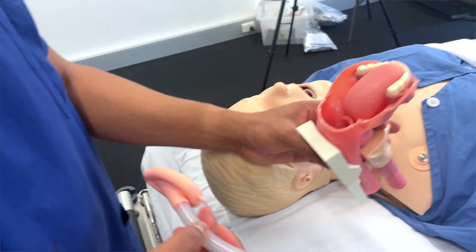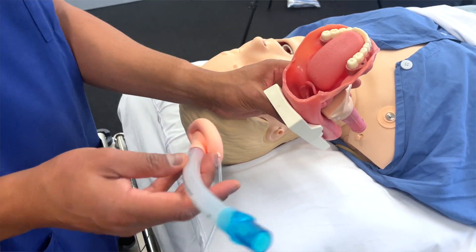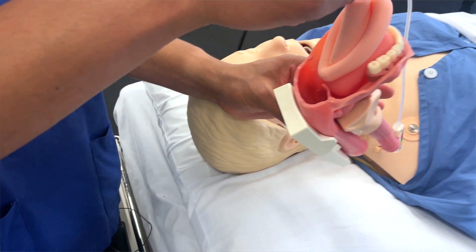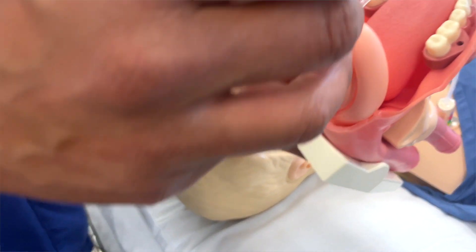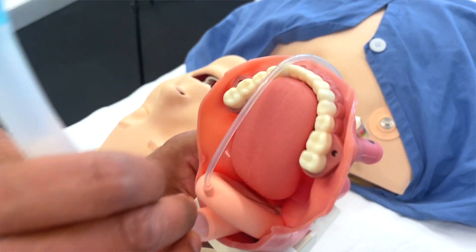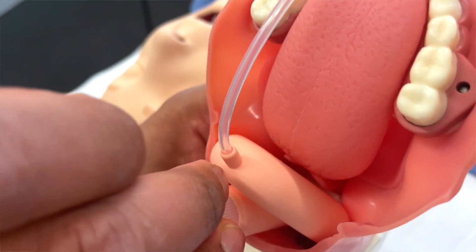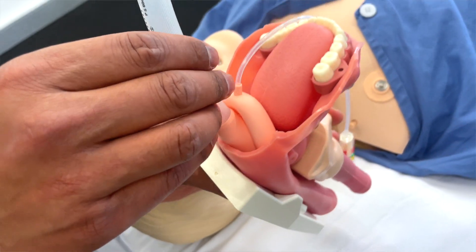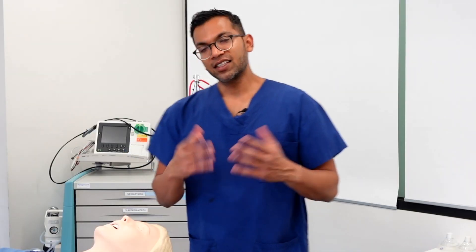I'm going to demonstrate on this airway anatomy model. Where I'm going to place this LMA is just sitting past the tongue, with the opening and aperture just above where the cords are. That way you'll get ventilation down this tube and into the airway.